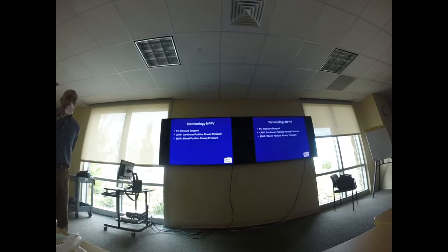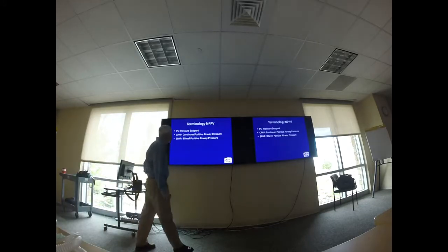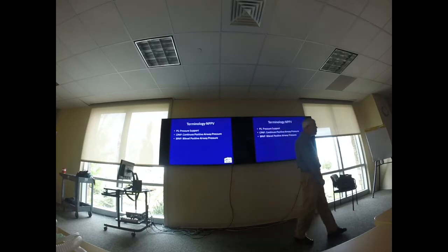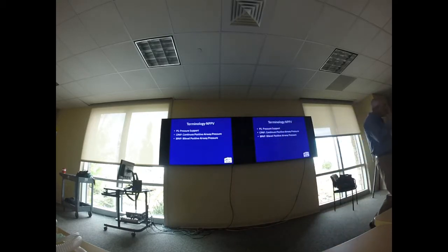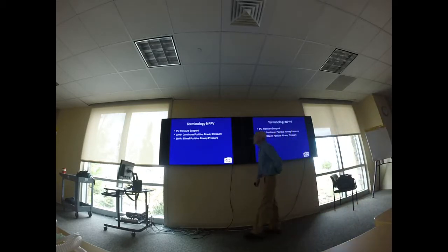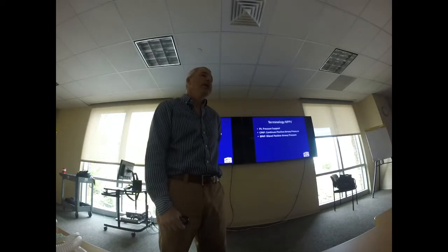All right, let's talk about non-invasive positive pressure ventilation. So when we talk about non-invasive positive pressure ventilation, we talk about pressure support, CPAP, and BPAP. I think the main way that we use pressure support in critical care transport is we use it in conjunction with synchronized intermittent mechanical ventilation.